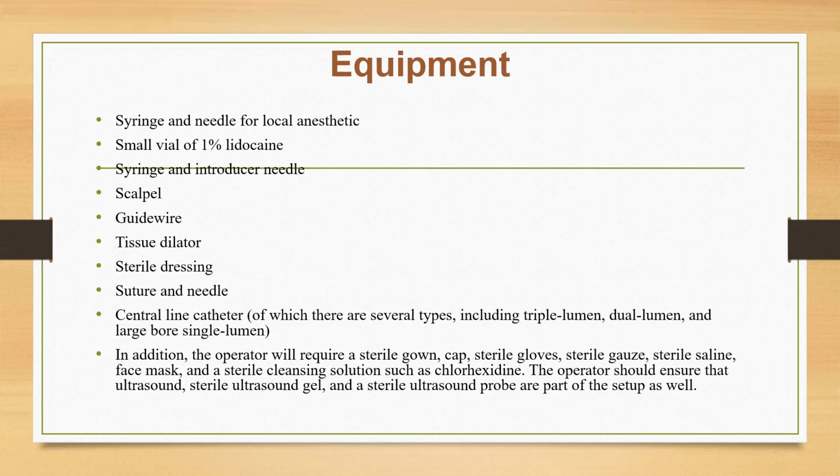In addition, the operator will require a sterile gown, cap, sterile gloves, sterile gauze, sterile saline, face mask, and a sterile cleansing solution, such as chlorhexidine. The operator should ensure that sterile ultrasound gel and a sterile ultrasound probe are part of the setup as well.